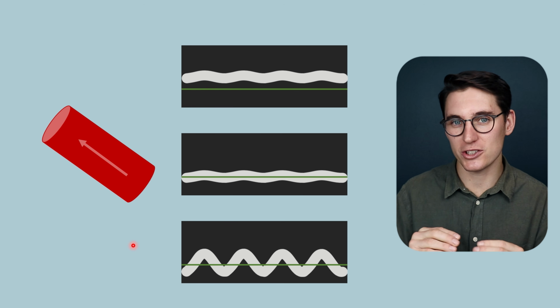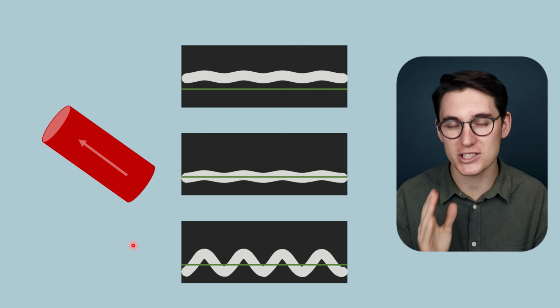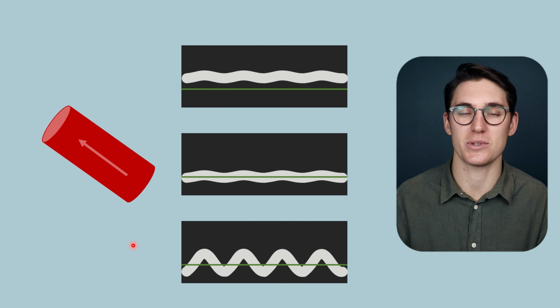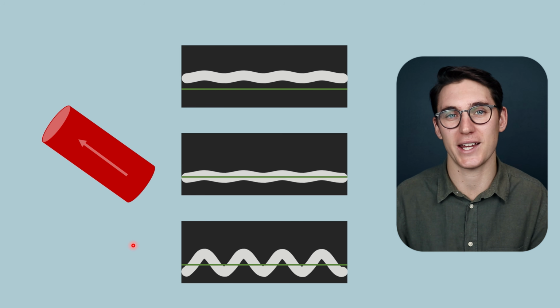And in the next talk, we're going to look at the concept of aliasing, where our pulse repetition frequency is not sufficient for the velocities within the blood. And we need to make different changes in order to compensate for that aliasing.